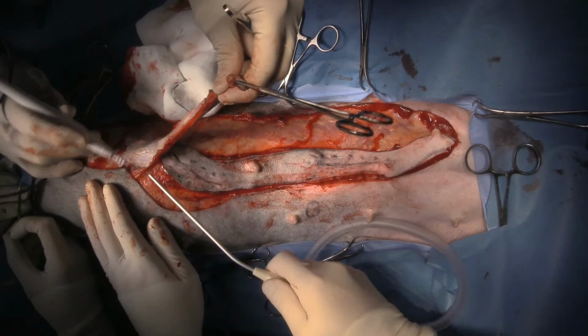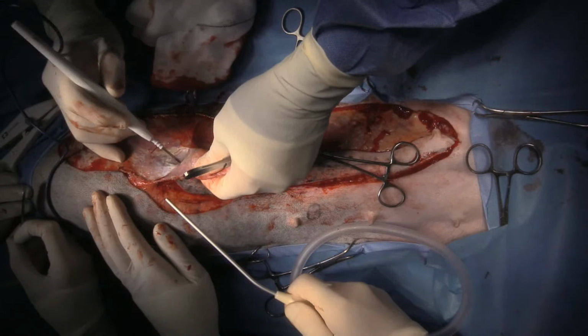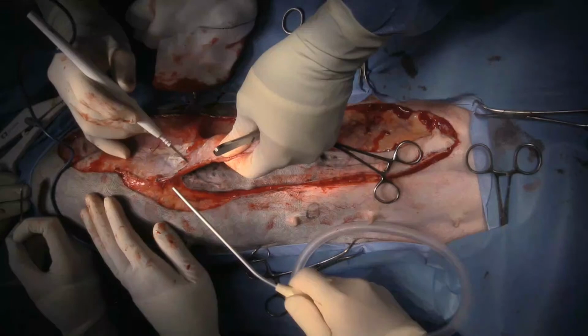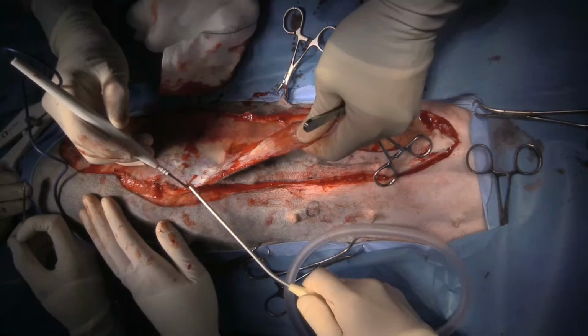I have a question for you guys listening or watching. If you were doing, how much does this dog weigh? 18, 19. So, in a 19 kilo dog, to close the abdomen after a spay, what size suture would you use? So you've got a little 7 centimeter incision. What size suture would you personally use to close the abdominal wall?